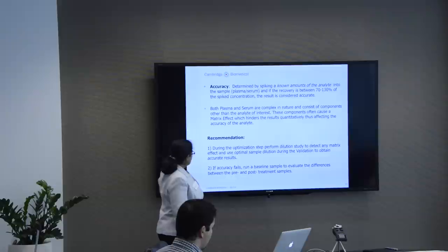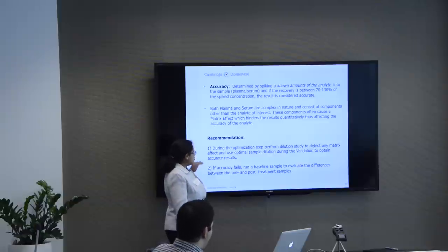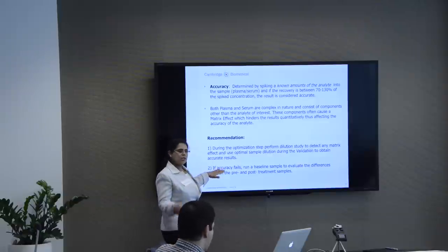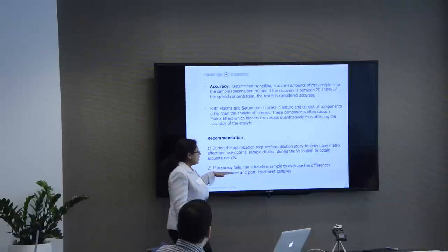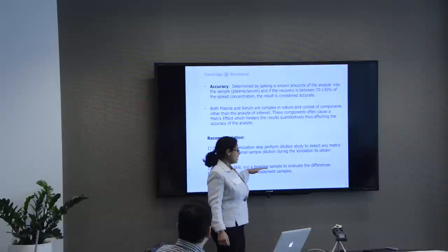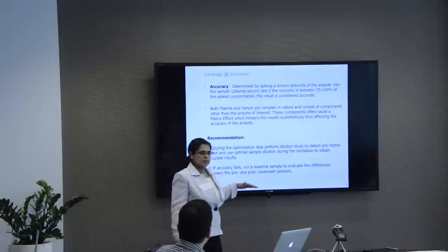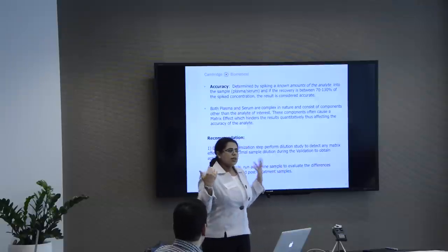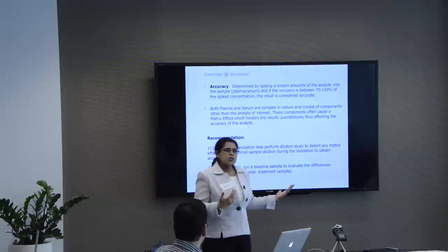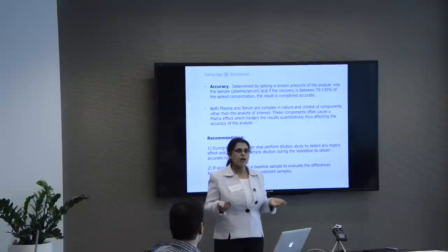So what we often suggest and recommend is, if accuracy fails, and you are not able to validate all those 15 cytokines in one run or one assay, you run a baseline sample, and then you evaluate the differences between the pre and the post treated samples, so that you can get a sense of, you have a clinical trial, you are using a drug, is it actually working? So it's going to give you a ratio, not accuracy.